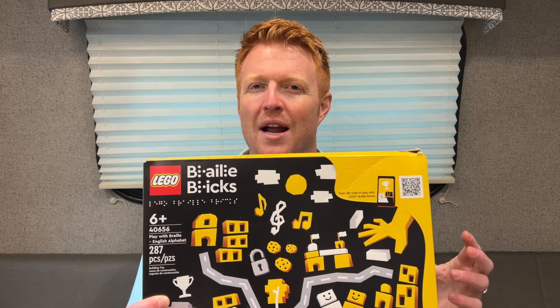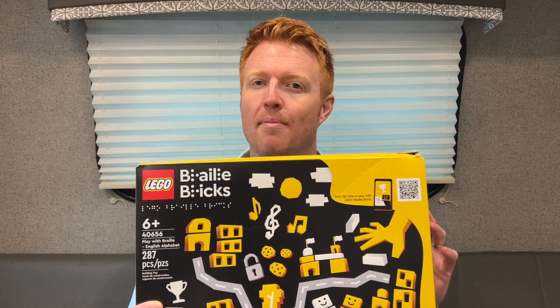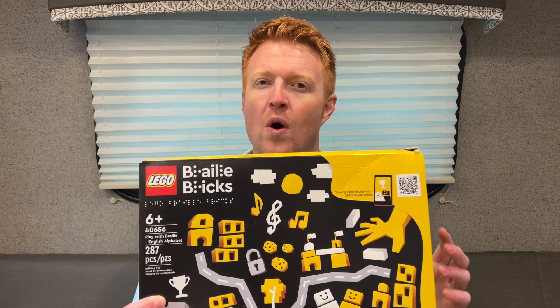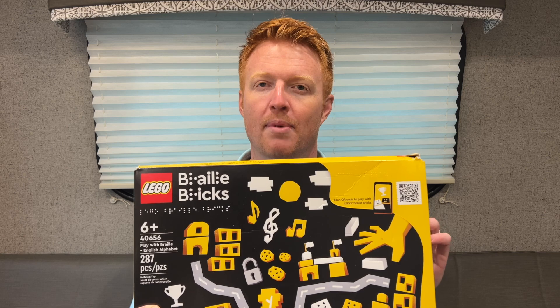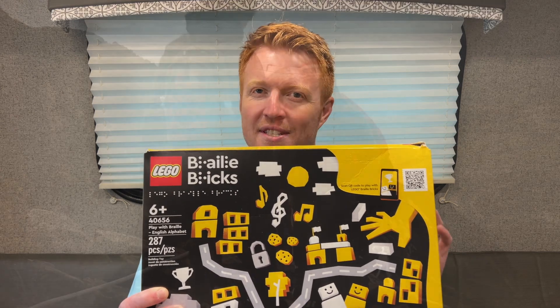Hey everyone, Mike Mulligan here from Blind on the Move. I am a vision rehab therapist, and today I'm going to be talking about Braille Bricks by Lego and how they can be a helpful tool for somebody who wants to learn or practice Braille. I'm going to show you what's inside this box and how it can be a helpful tool for that learning and practicing of Braille.